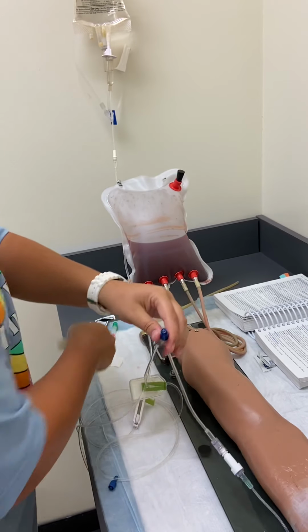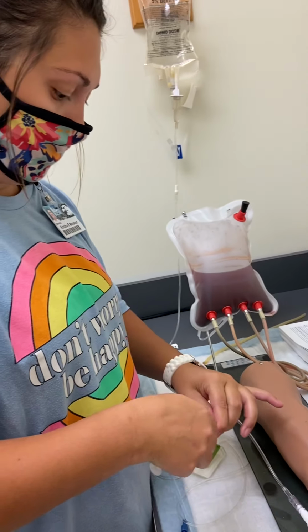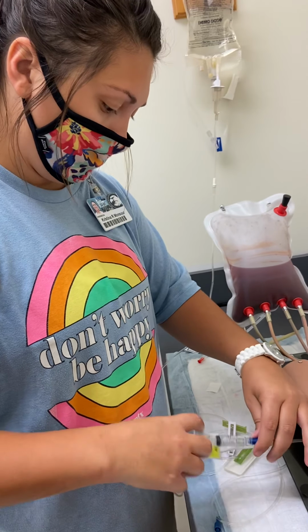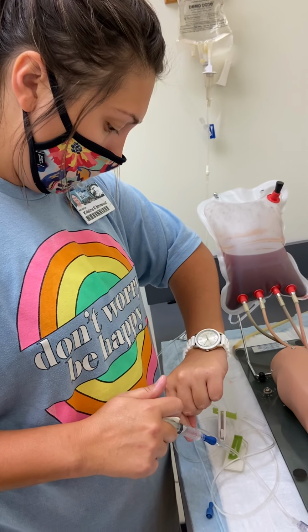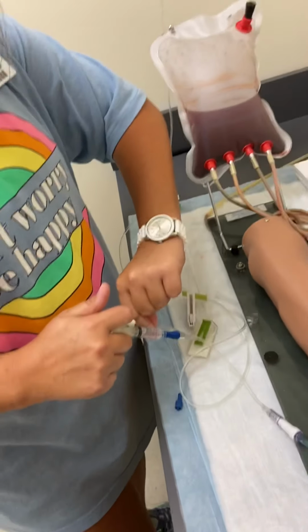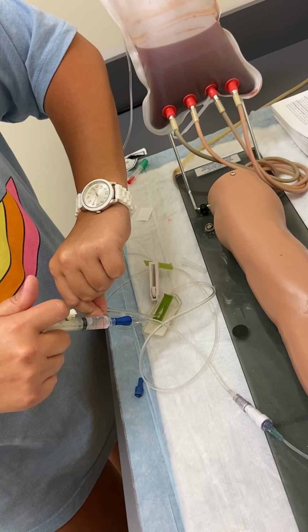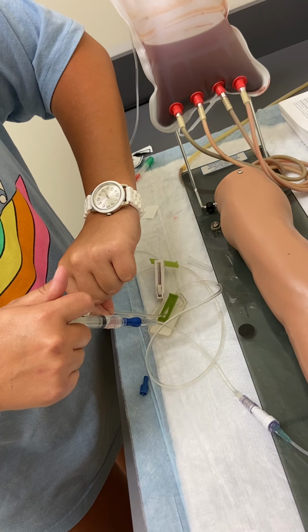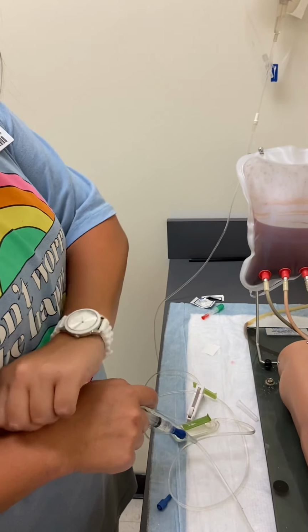Also, Mr. Smith, if you feel any burning or tingling or itching while I'm giving you this, please let me know so we can stop it and I can monitor you for adverse effects. I'm pushing this over 2 minutes. So I'm going to clamp it off. I have 4 milliliters, so I'll be doing 2 milliliters a minute. Okay, and then I'll let it flow for the rest of my minute.